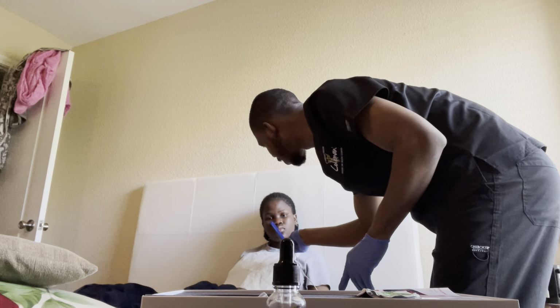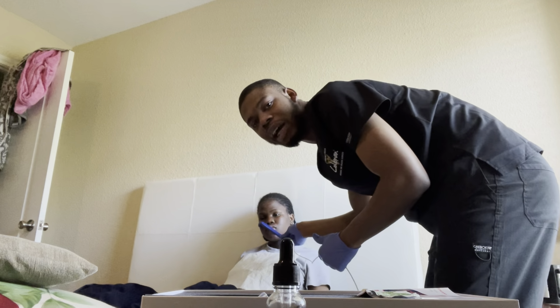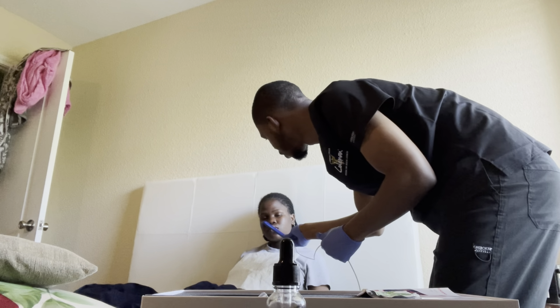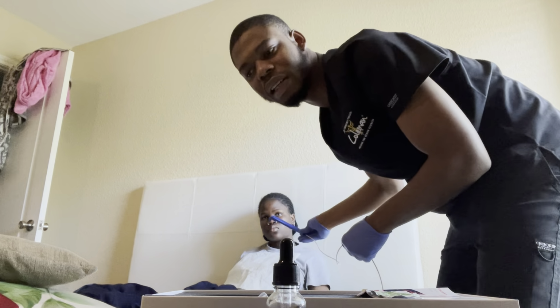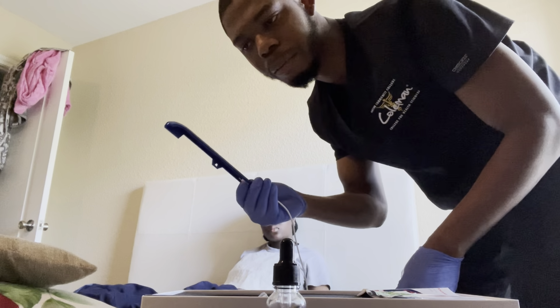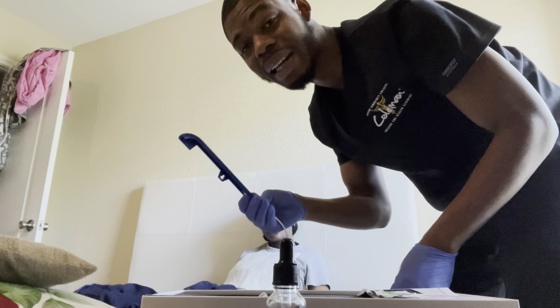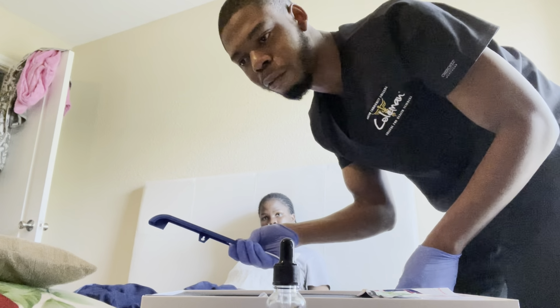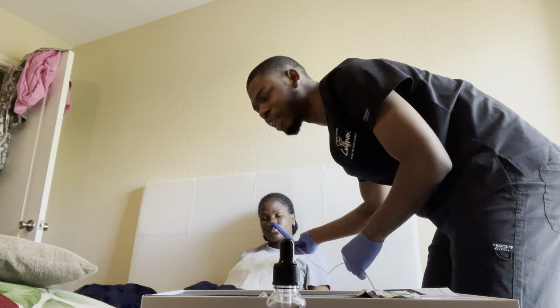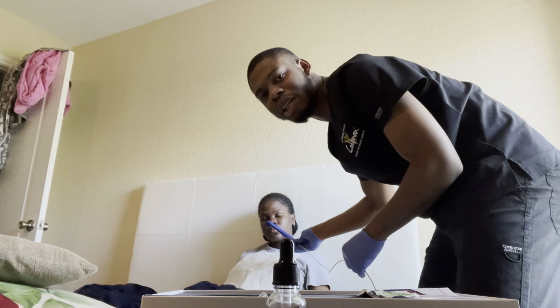I will be suctioning it, and now I take my hand away from the vent. If I meet an occlusion on my way putting the catheter into the patient's nares, that means I might have hit the carina. So I will roll it back about 1 to 2 centimeters before I apply suction again.